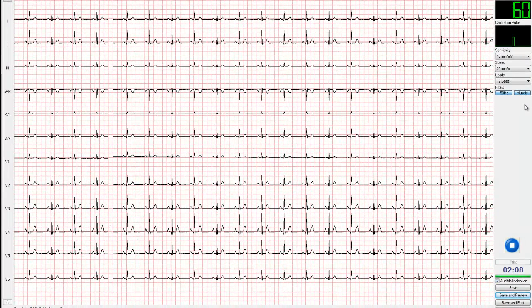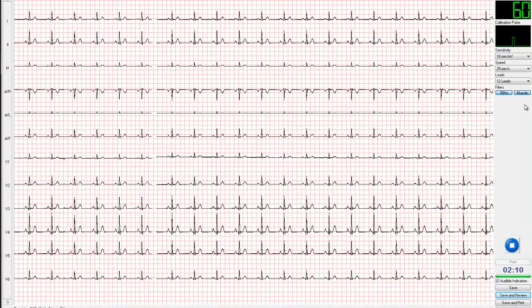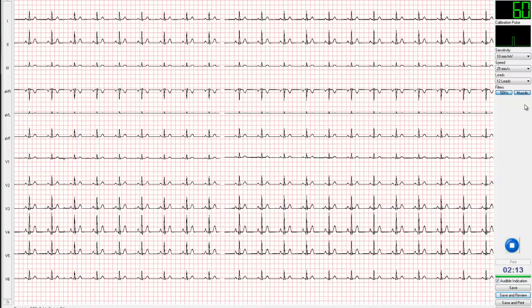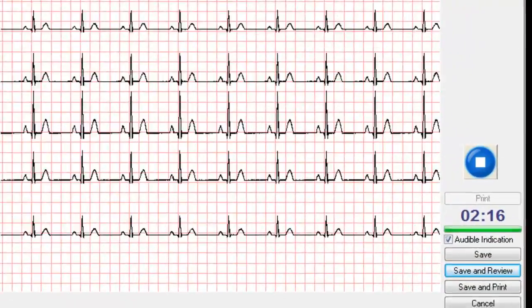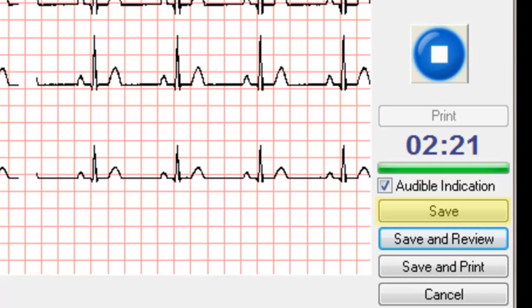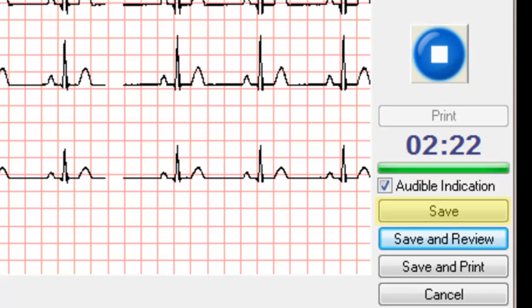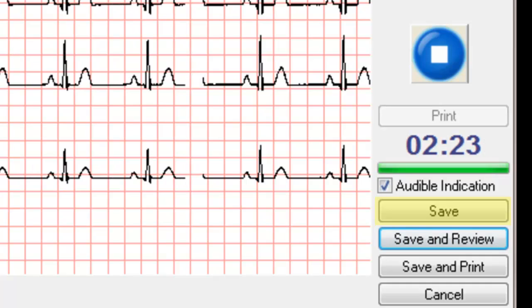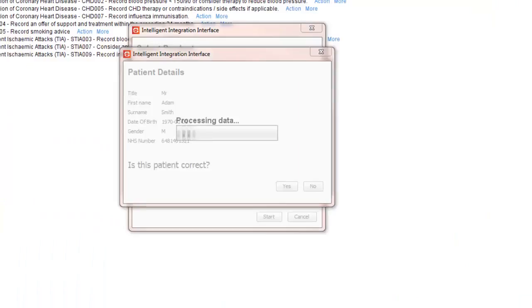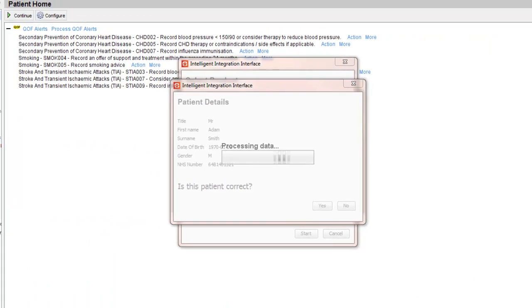Monitor the ECG waveform on the screen. Once you have observed at least 10 seconds of a good quality trace on all leads, you are ready to acquire the ECG by clicking the Save button. When the Save button is clicked, the previous 10 seconds of ECG recording will be captured, and you will be taken immediately to the filing process.